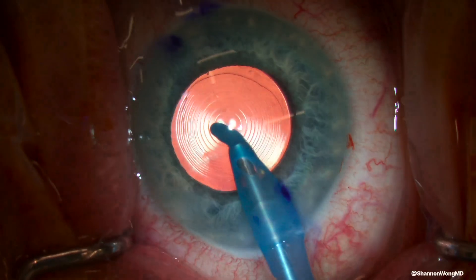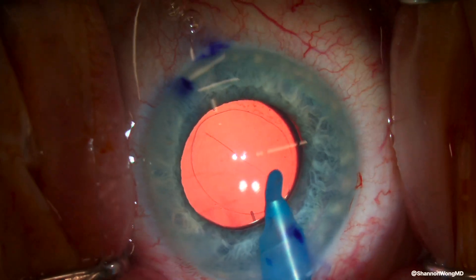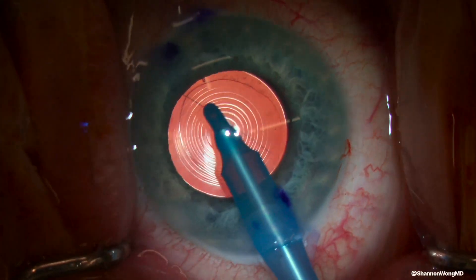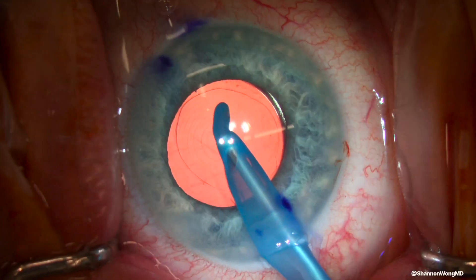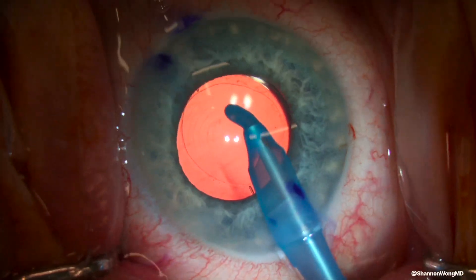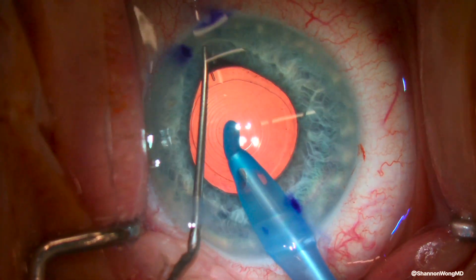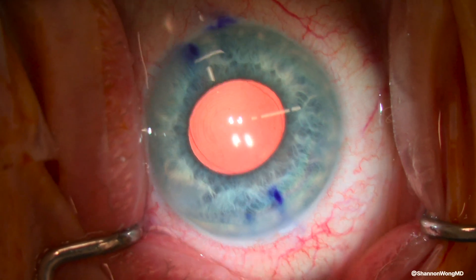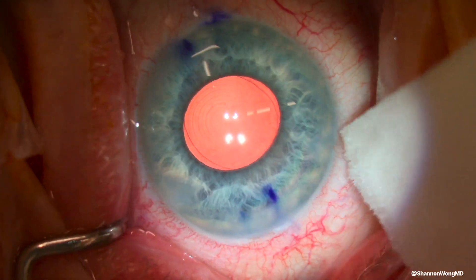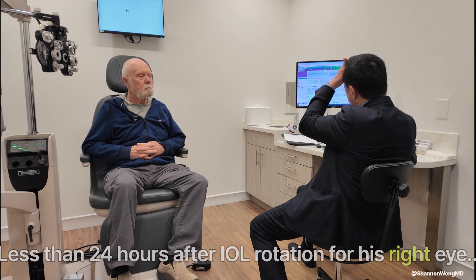We can see the alignment marks of the lens implant and they look like they're in the correct position, but as we continue to work, the pupil constricts. Therefore, we use a Lester pusher to help us visualize the axis mark at the 11:30 position. Once we determine the alignment marks are in correct orientation, the case concludes.